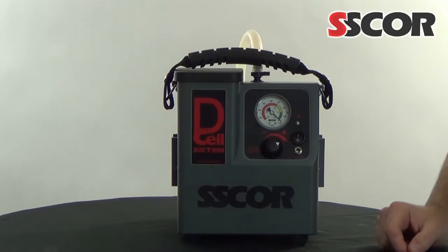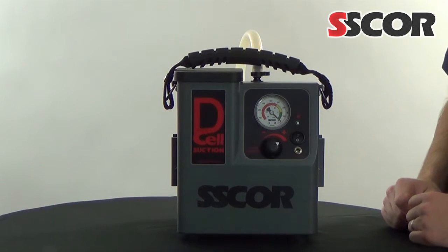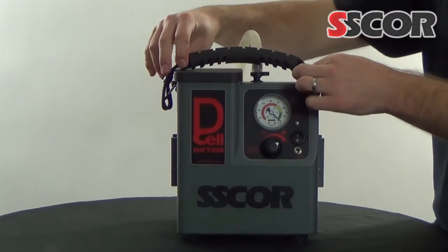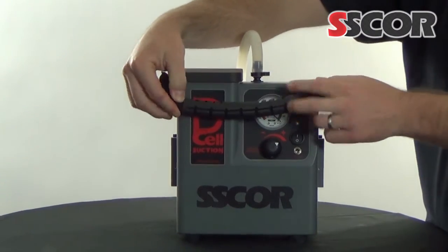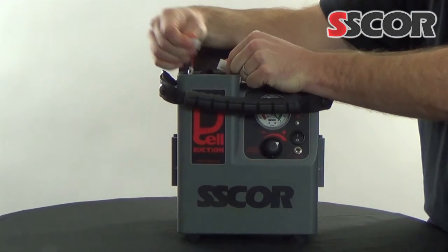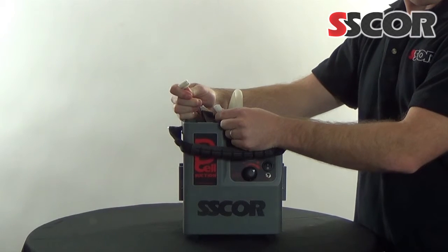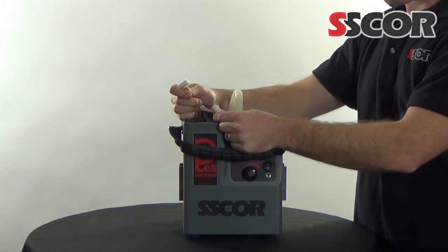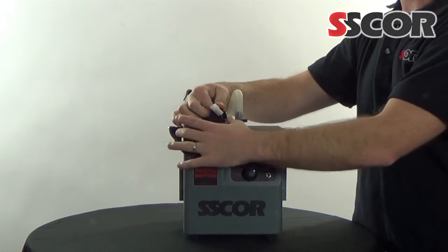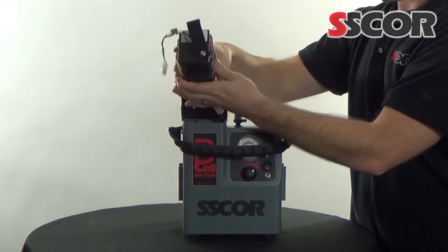When filling the 12x DCell battery holder assembly for the first time or replacing the batteries, access the battery holder assembly by opening the top of the chassis. Disconnect the Molex on the 12x DCell battery holder assembly from the wiring harness. Once it is disconnected, lift the 12x DCell battery holder assembly out of the chassis, noting the orientation of the battery holder. The battery holder will only fit in this orientation.